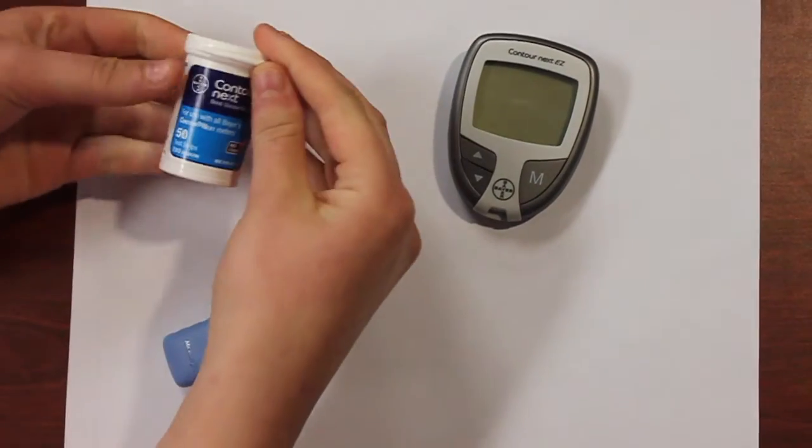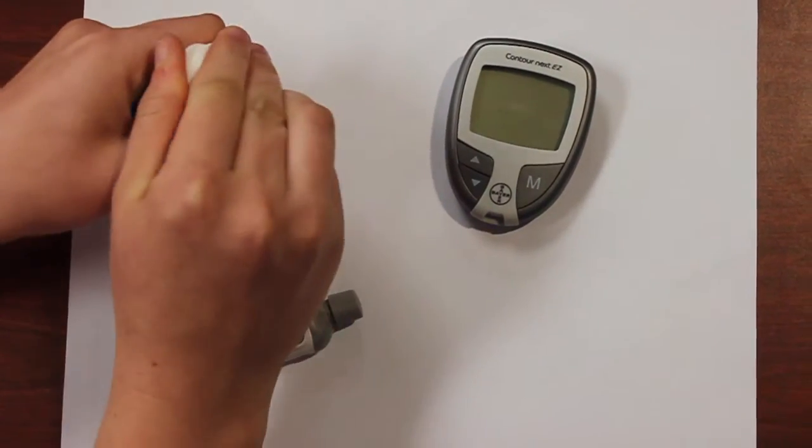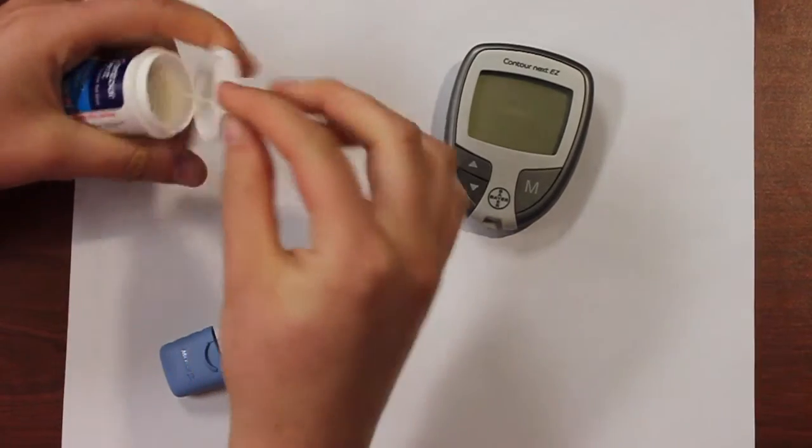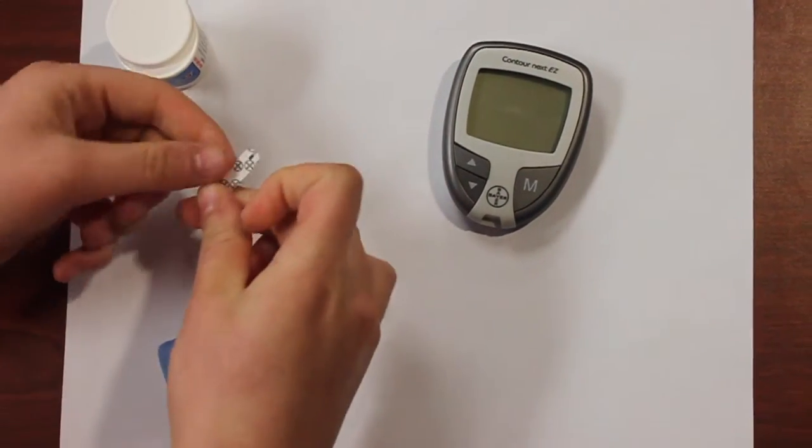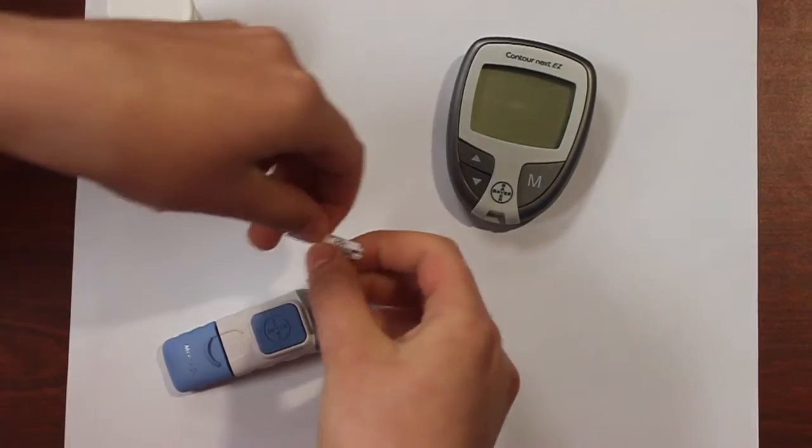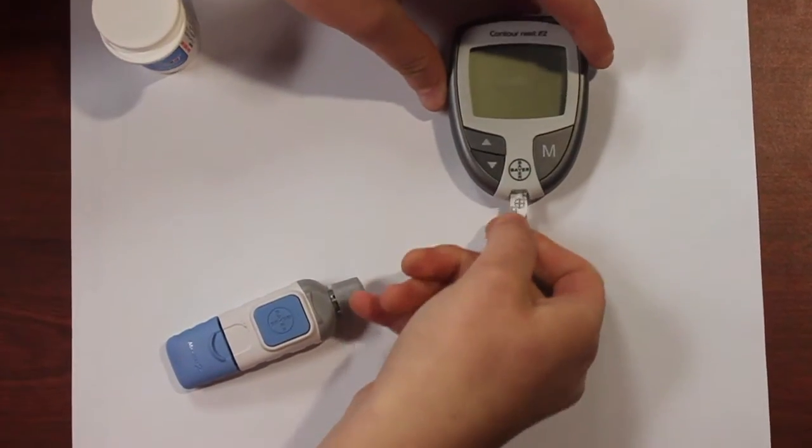In order to use the glucometer, first use a Contour Next test strip provided with the device. It is about the size of the tip of your index finger. Then place the test strip into the port on the meter.